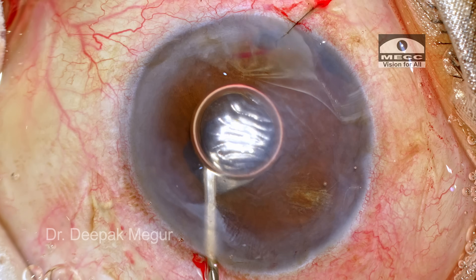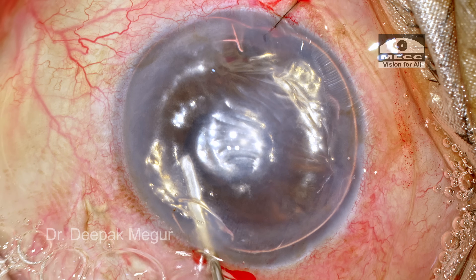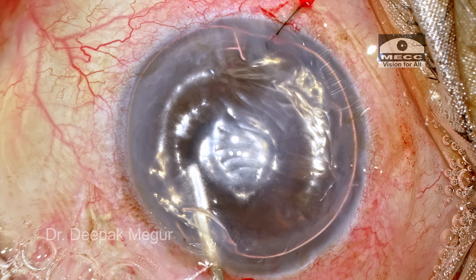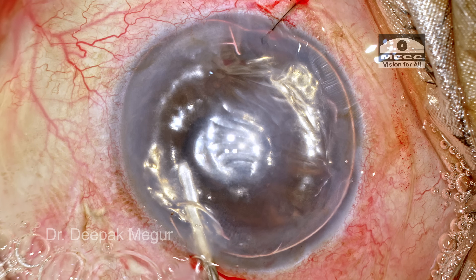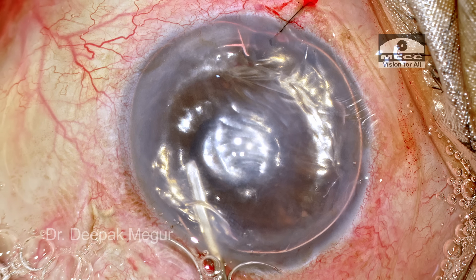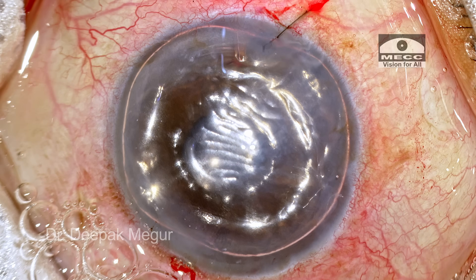I'm going to inject the gas through the new incision I created. To prevent the gas from coming out, I'm occluding the port by keeping the cannula oblique and waiting there for a couple of minutes for the gas to pressurize the chamber, hopefully reattaching the membrane. Because the moment I come out, there is always going to be some gas escape. My goal is to ensure that when I close the eye, I have at least 80% of the chamber filled with gas. After waiting about 3 minutes, I come out and the chamber is still filled with gas.